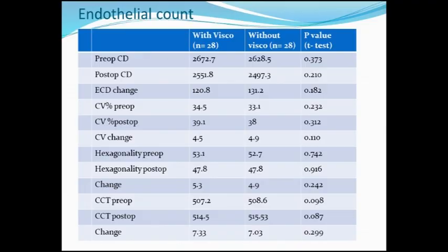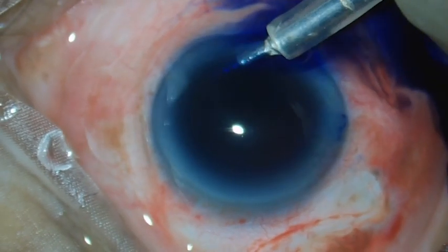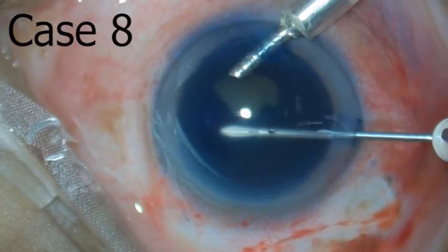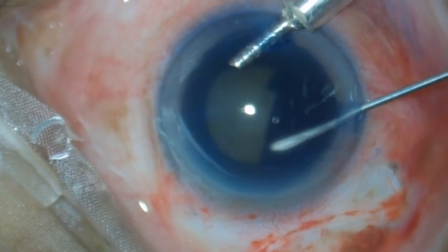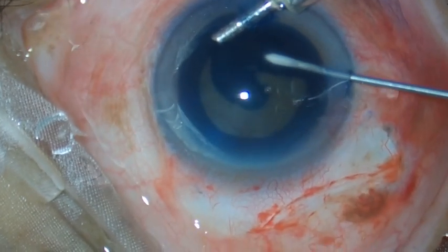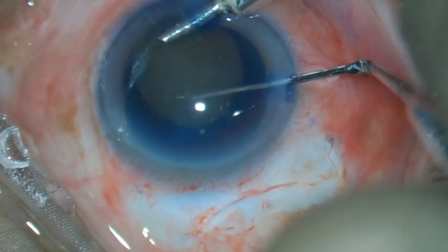This is a slide showing our study. In a pilot study done at our center, endothelial count studied between the visco and non-visco group does not show any statistical difference. Now I would like to demonstrate three more visco-free cases in small incision cataract surgery.